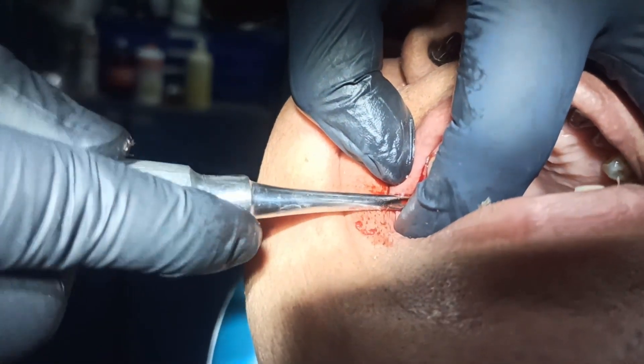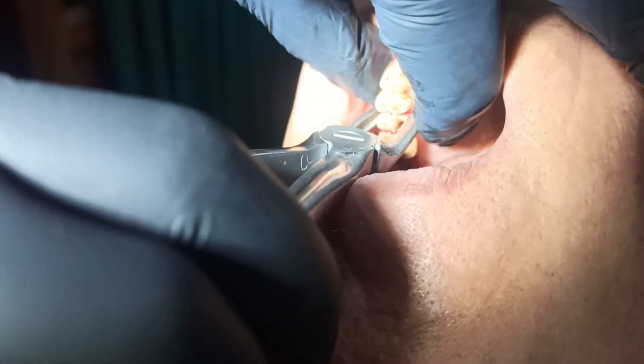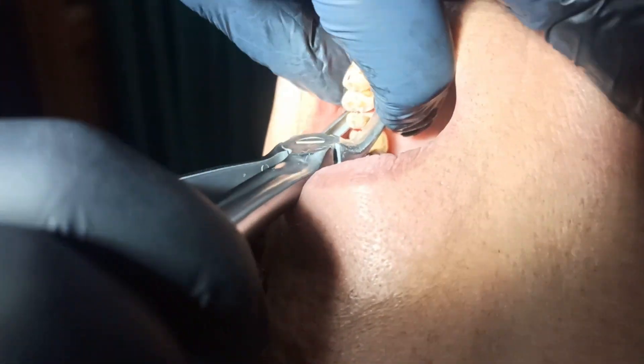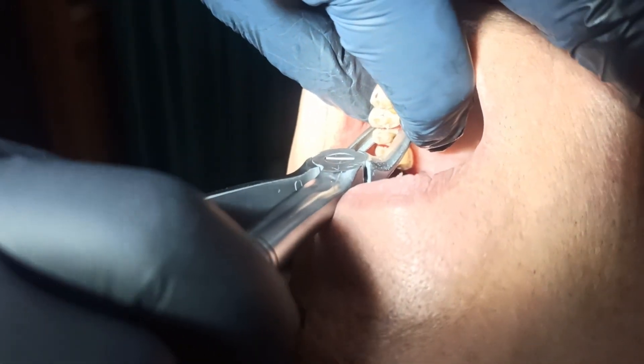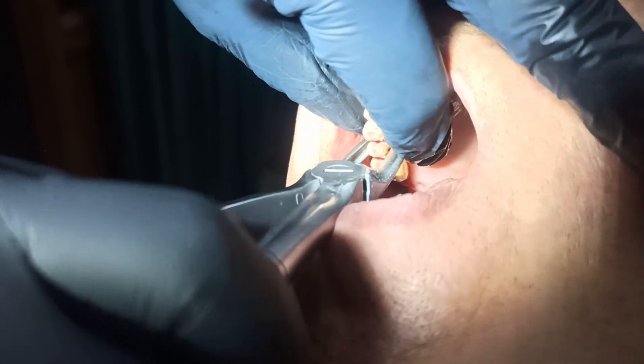Side here. Here, here — have to keep it here. Okay, okay, okay. There.